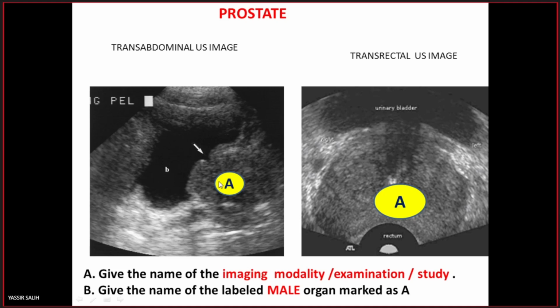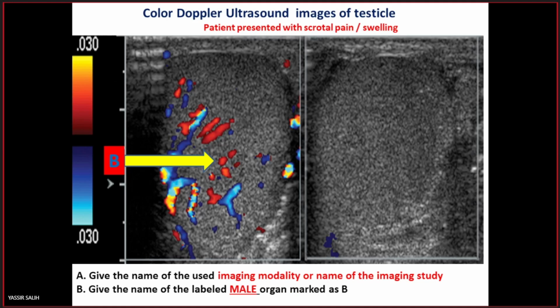Doctor, in the previous slide, transabdominal. Yes, sorry, how are we going to go back to it? The imaging modality is only ultrasound, yes, or color Doppler ultrasound? Only ultrasound. Color Doppler ultrasound is for the imaging study.